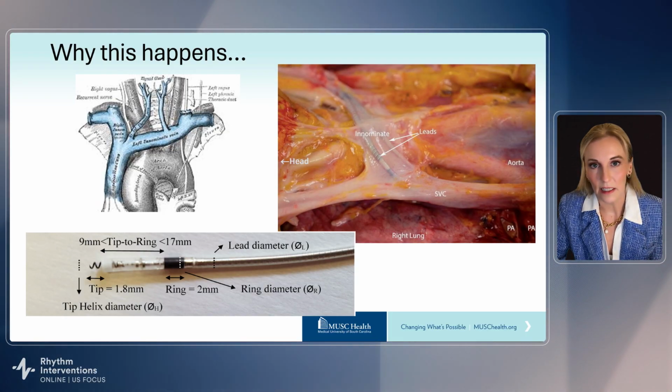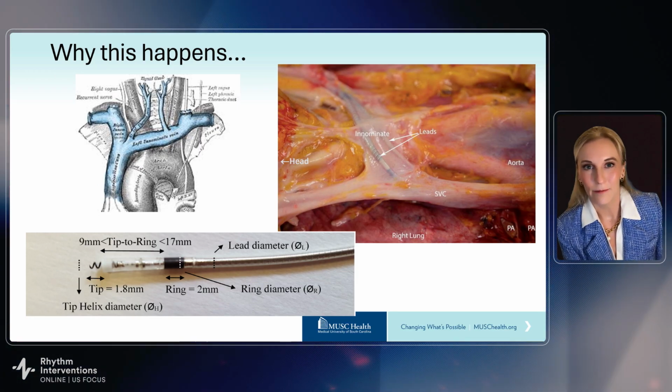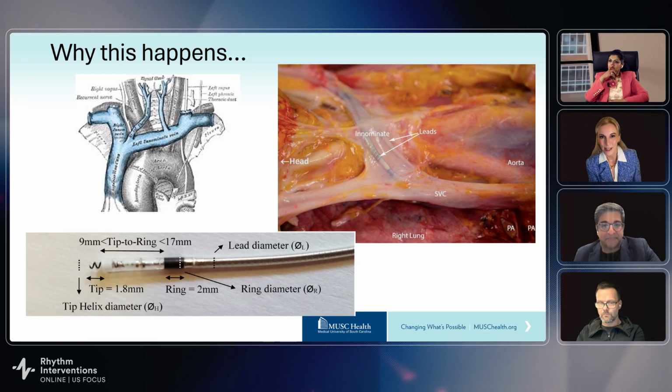So just to ask Ro and Oliver, have you guys ever seen this come through your practice, where you get this exact fragment of a lead left behind?